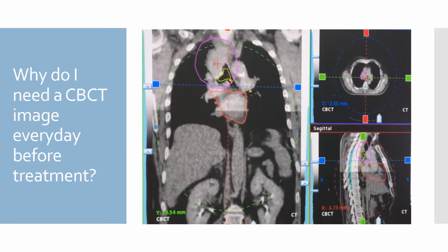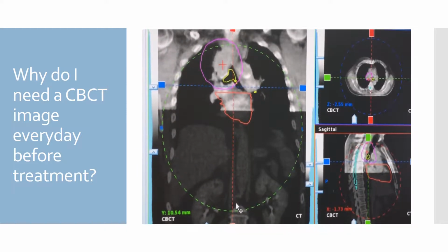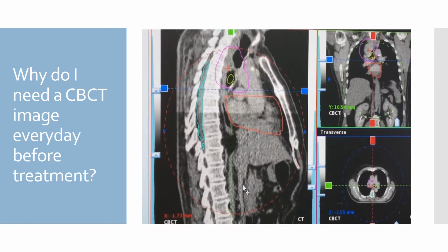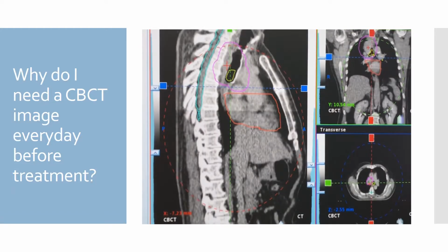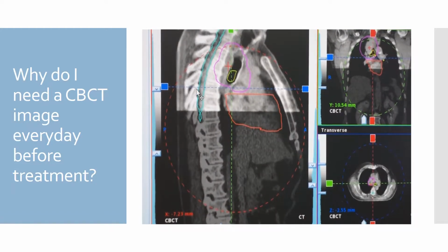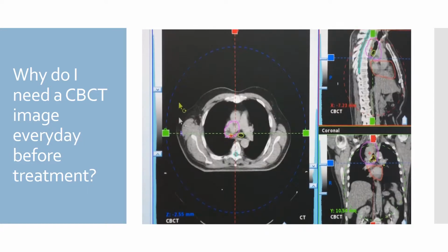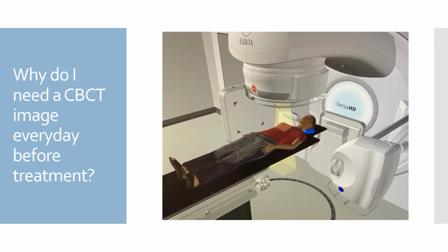Imaging gives us the ability to overlay the daily image with your treatment plan. Your treatment plan was created using the images taken during your CT simulation. This video shows the therapist switching between images and making adjustments until they are a perfect match. Daily imaging ensures you are getting the most accurate and precise treatment, and sparing your normal healthy tissue as much as possible.